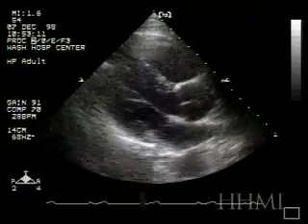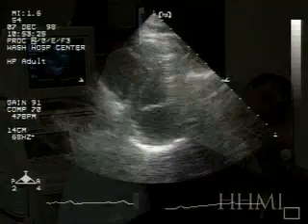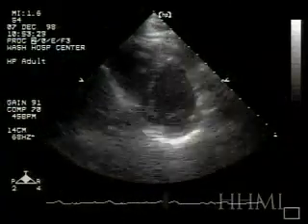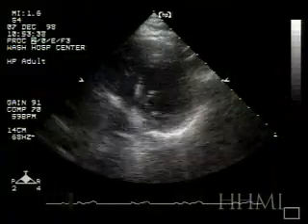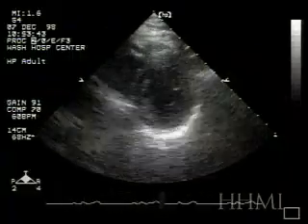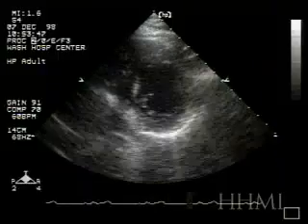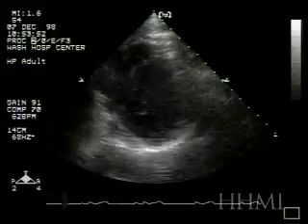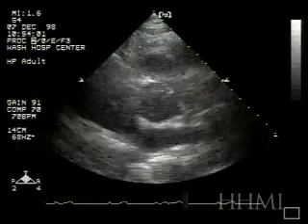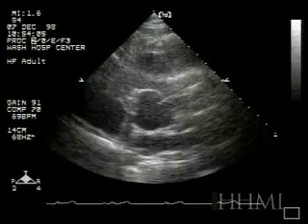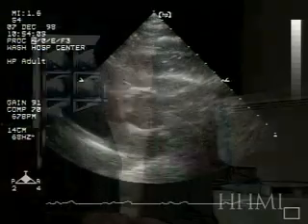We're now going to do one final view of the heart in which we are going to take cross-sectional views, looking from the base of the aorta, the base of the left ventricle up to the apex, and be able to have a look at how the heart contracts in a sequential donut-type appearance. This is the left ventricle beating rhythmically with nice normal contractions in all of its different walls, at the level of the mitral apparatus, which you see opening and closing within this region. As we progress up towards the top of the heart, we are going to begin to enter towards the aortic valve, and see that opening and closing — here it is right here — as the blood exits the left ventricle and goes out into the systemic circulation.